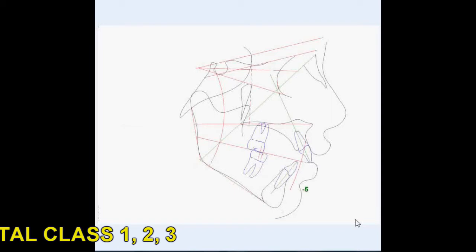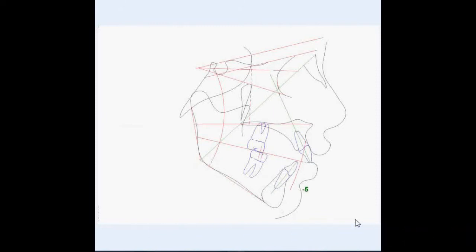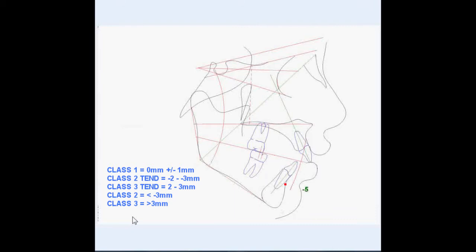The first question we're going to answer is the skeletal AP or classification. Is the patient skeletally class 1, class 2, or class 3? In order to determine this, we look at the position of B point compared to the A arc. If B point is on the arc or one millimeter in front or behind the arc, the patient is class 1. If B point is 2-3 millimeters behind the arc, the patient is class 1 with a class 2 tendency. If B point is 2-3 millimeters in front of the arc, the patient is class 1 with a class 3 tendency. The farther behind the arc, or more negative the number, the more class 2 the patient is. The farther in front of the arc, or more positive the number, the more class 3 the patient is.